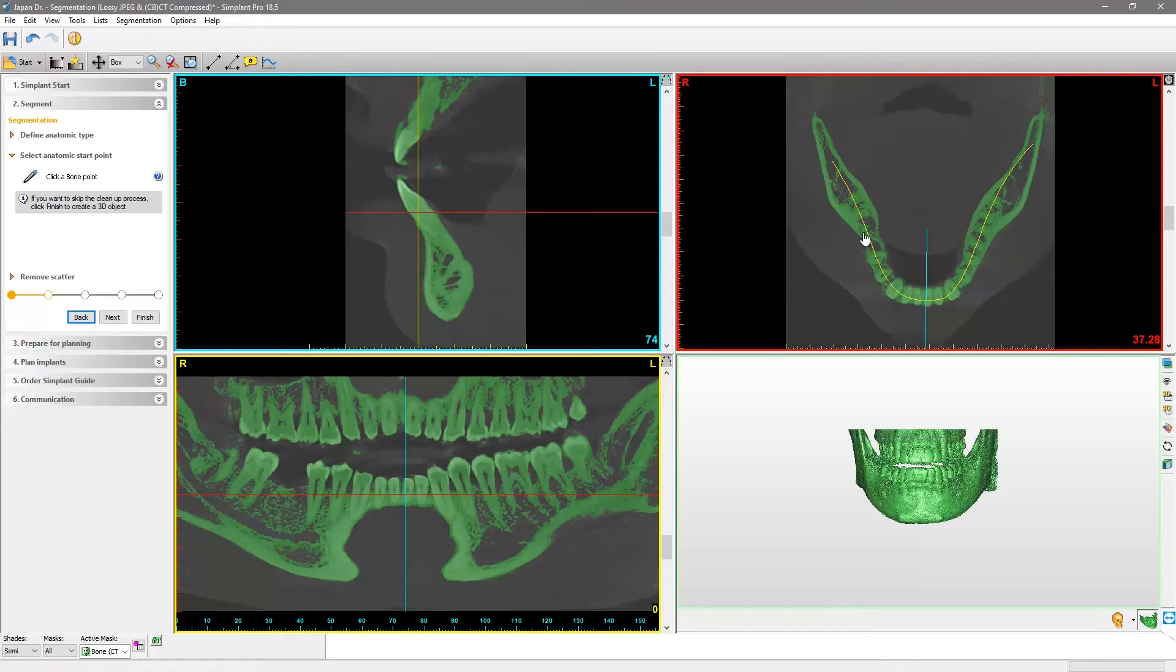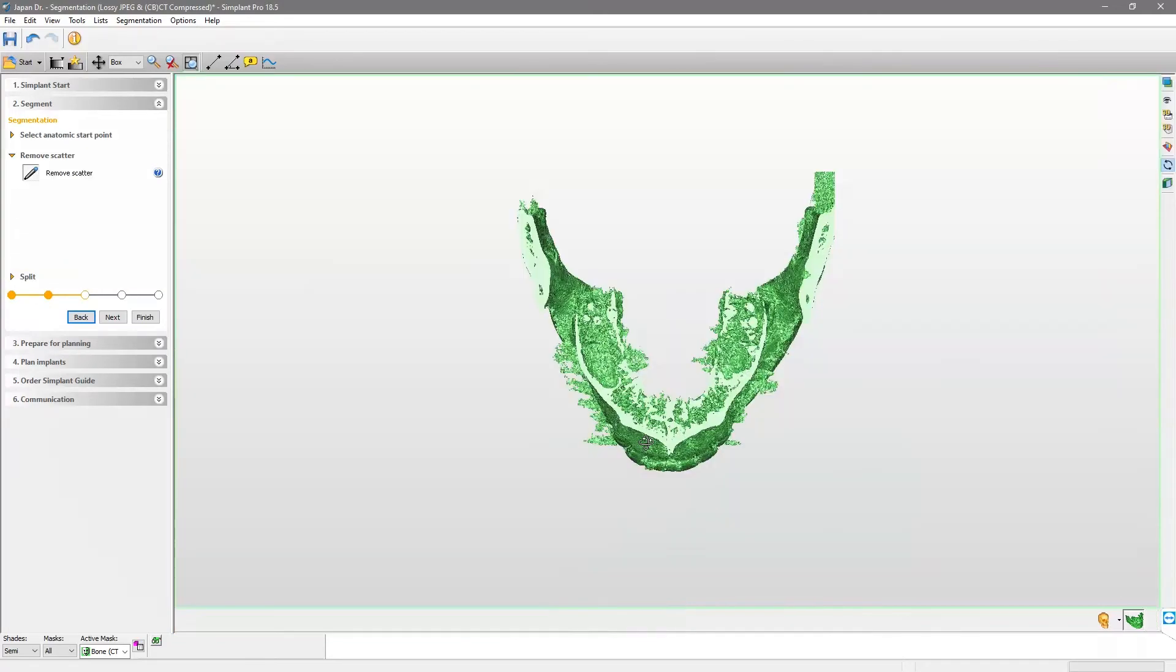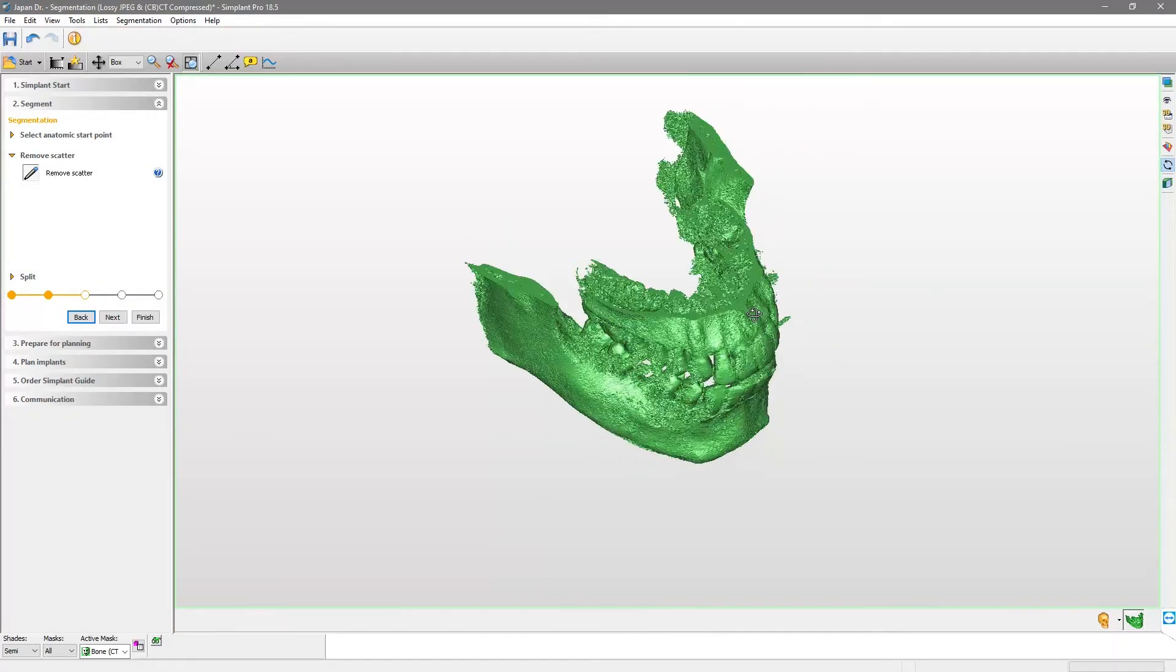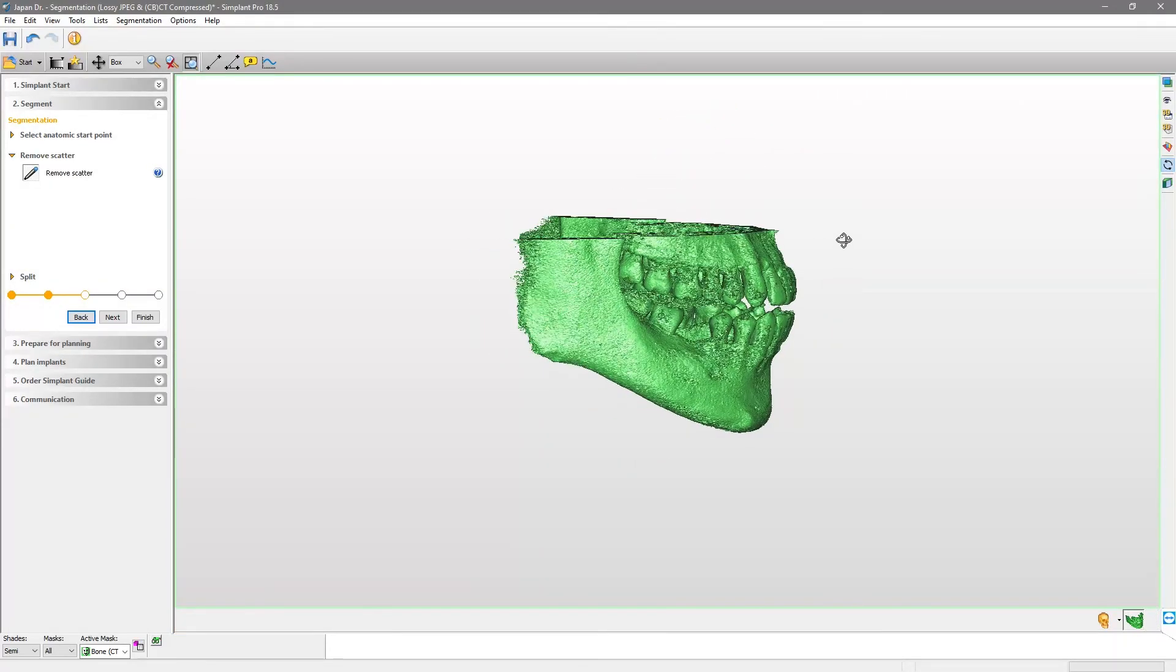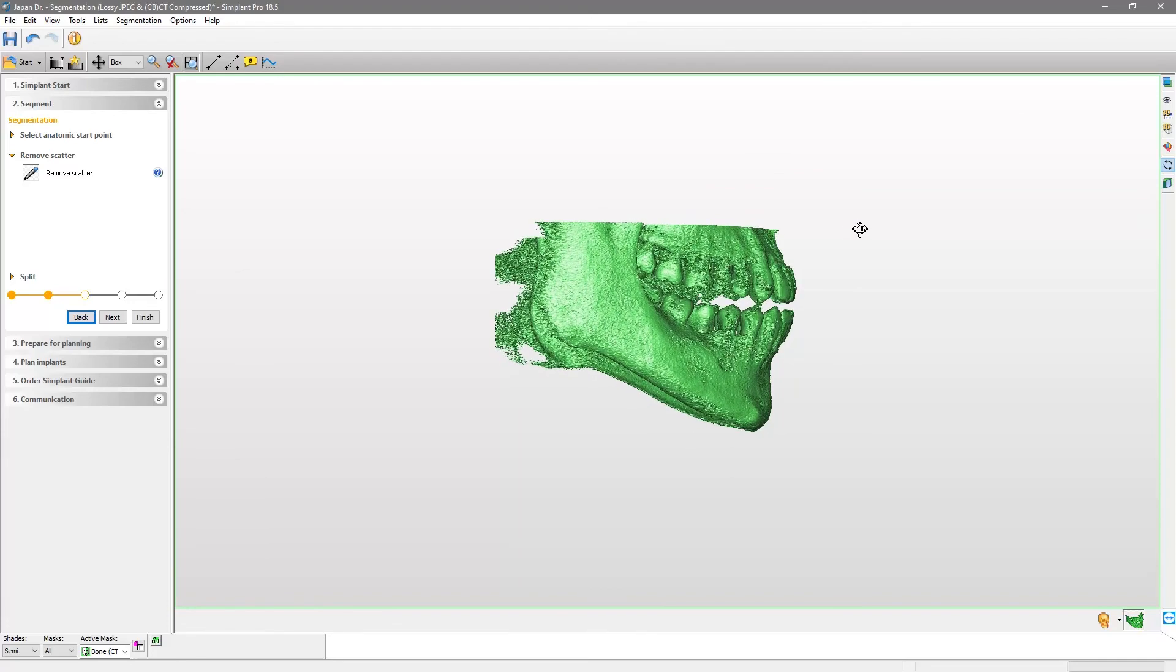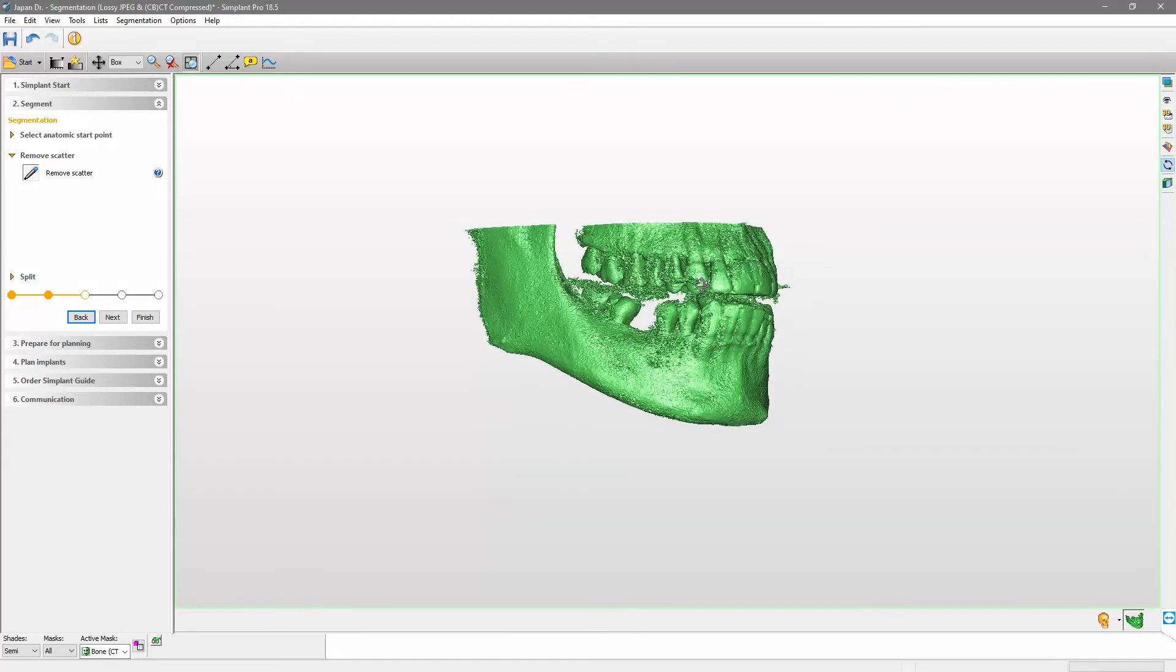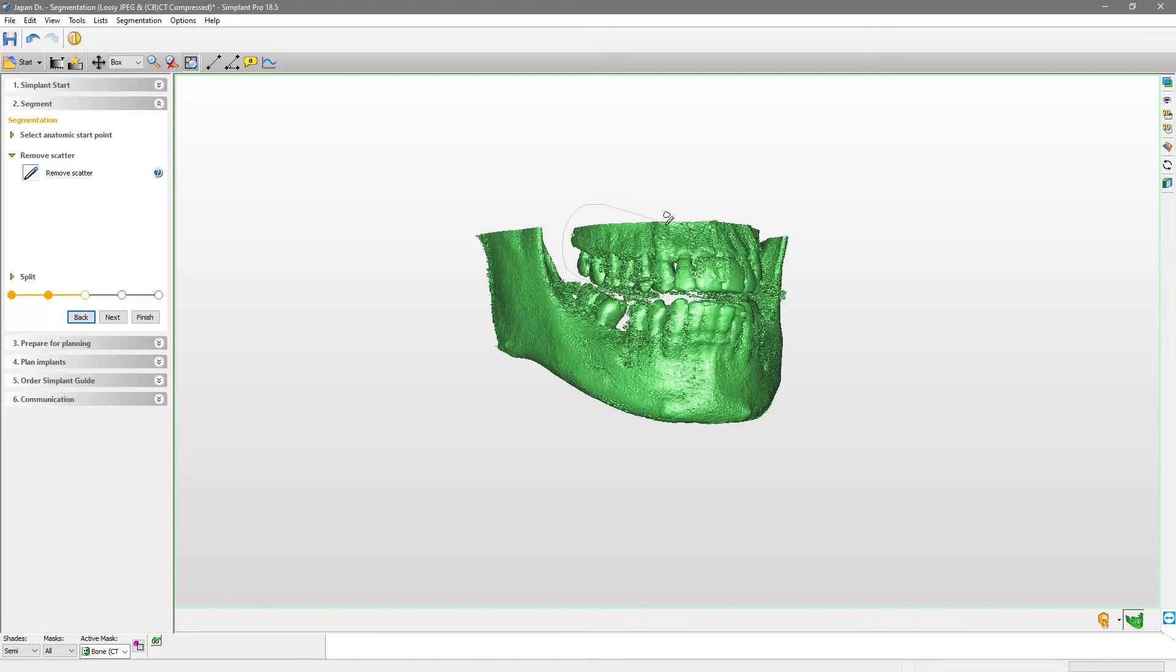If the model presents undesired scatter in the 3D view, you can remove it. To demonstrate it, we will tap on the option Remove Scatter. By clicking and holding the left mouse button and dragging a circle around the area that you want to remove, it will be deleted.